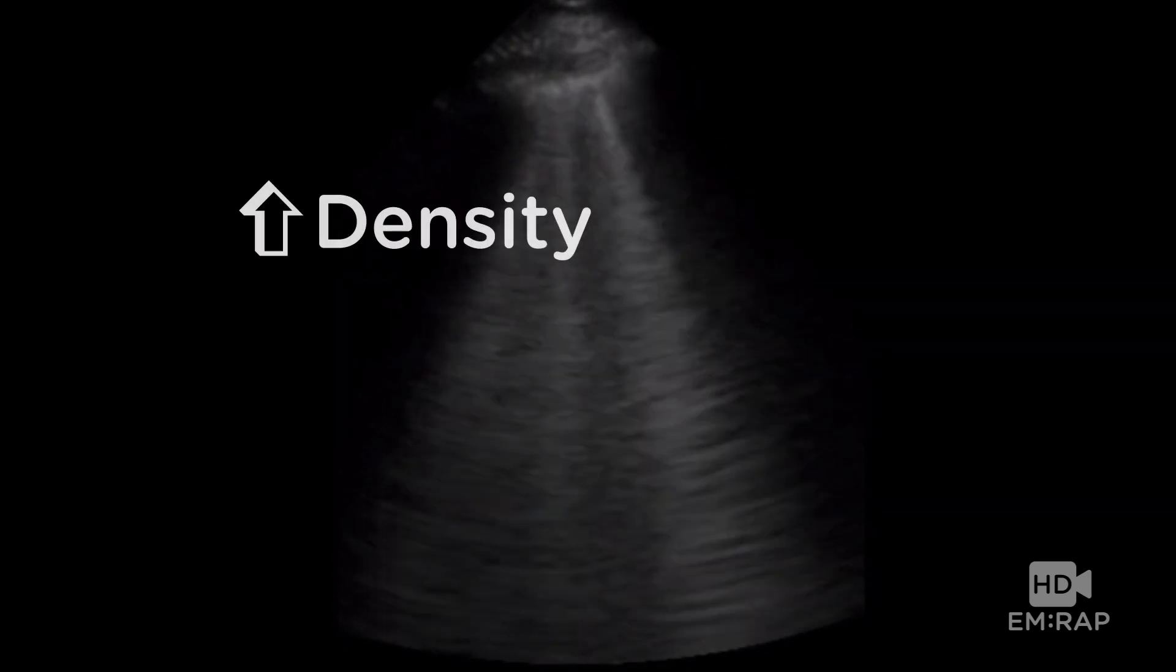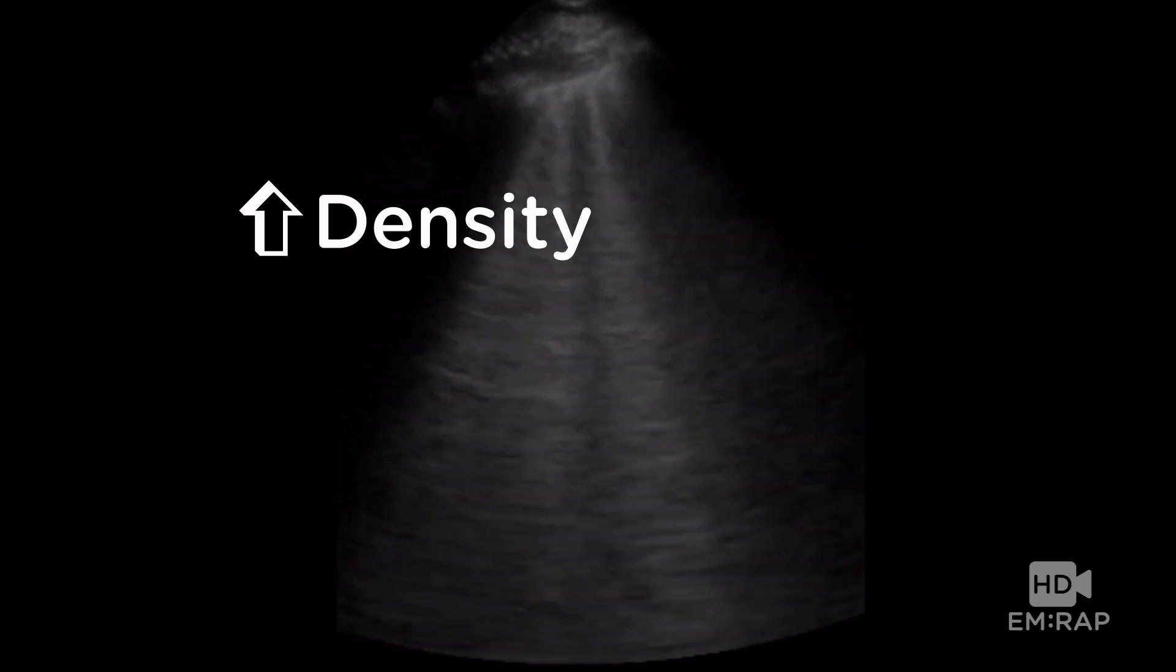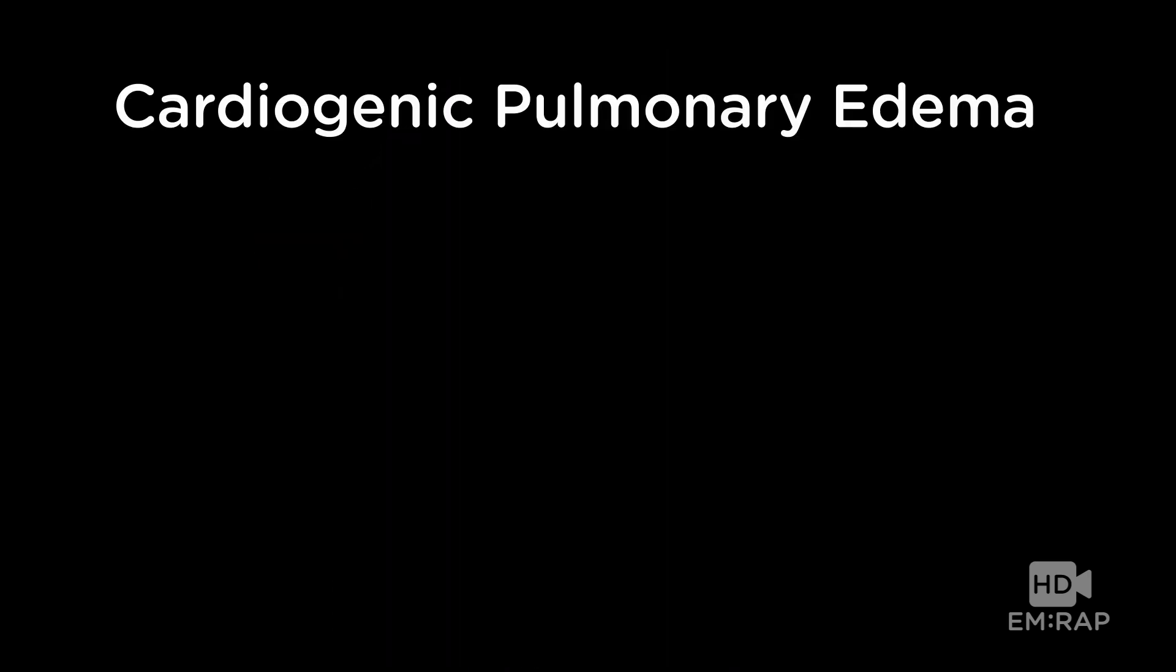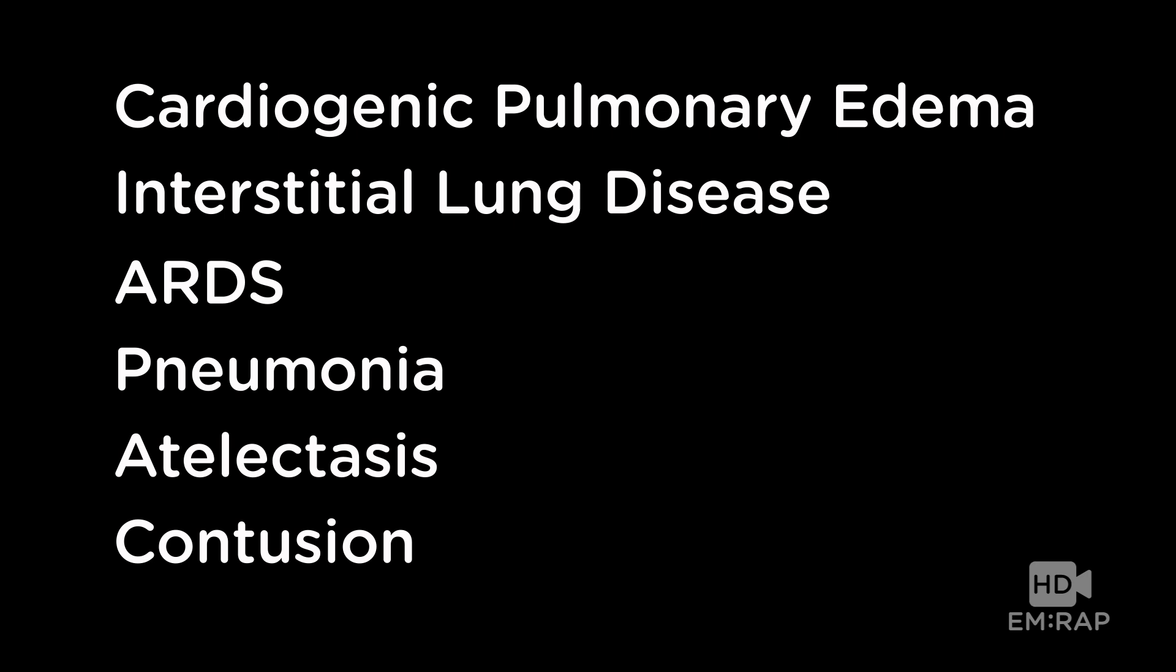Now the thing that I have to mention here is that the presence of a positive zone doesn't necessarily mean that the patient has cardiogenic pulmonary edema. B lines technically are caused by any kind of increase in density in the lungs. Increase in density definitely happens with cardiogenic pulmonary edema. The lungs get soggy, but you can also have that with interstitial lung disease, ARDS, pneumonia, atelectasis, pulmonary contusions. All these things can cause B lines. So you have to make sure to look at the patient in front of you and don't use that ultrasound in isolation.